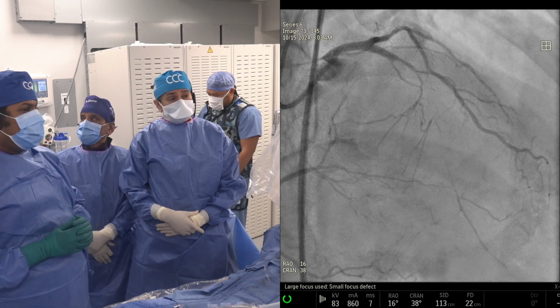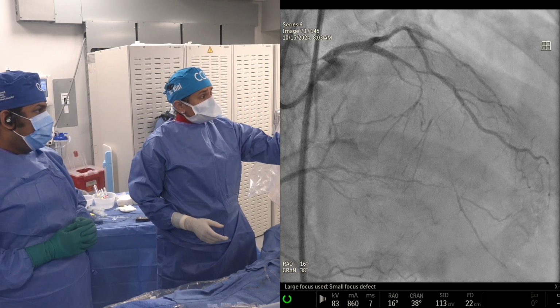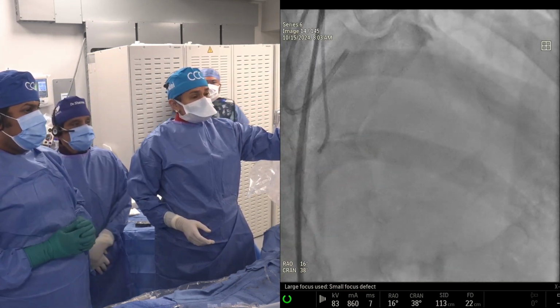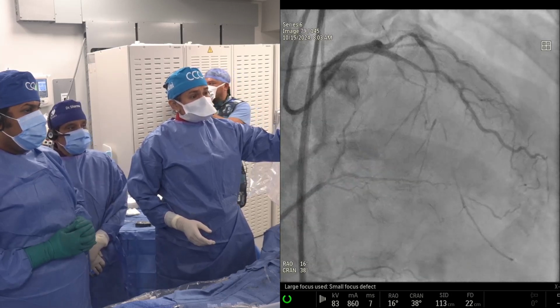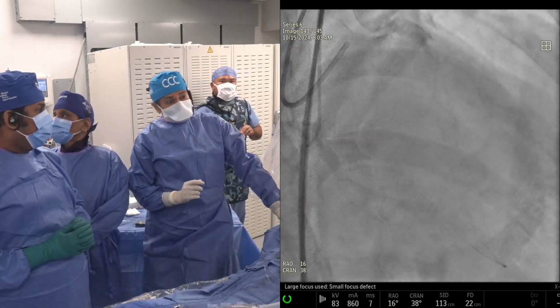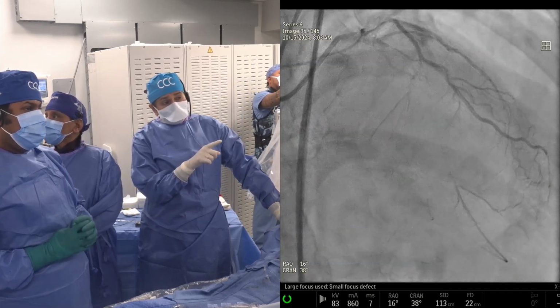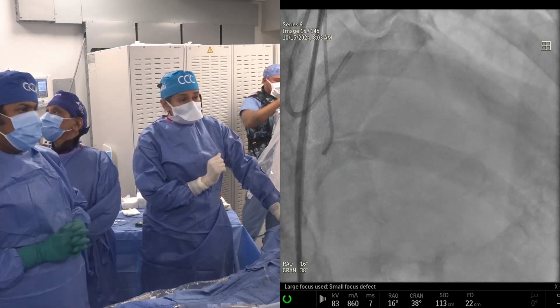Right. The distal LAD was only seen when we did the RCA picture, especially with this, we cannot call it a circle of Vieussens, but since it's not from the conus, but you see it, it's almost, yeah, okay, it is. Yeah, it is from the conus. Yeah, circle of Vieussens. Which also gives you some suggestion as to the chronicity, no? Yes. So only from the RCA injection could we see the LAD collaterals, even in our diagnostic.